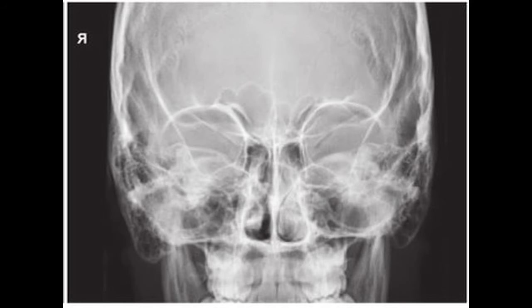When you're evaluating the Caldwell image, you want to make sure that you, of course, have proper collimation, just like with any image. The frontal sinuses are lying above the frontonasal suture, and the anterior ethmoidal air cells are lying above the petrous ridges.